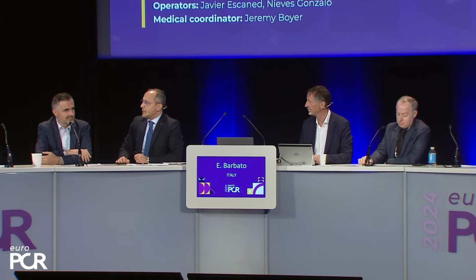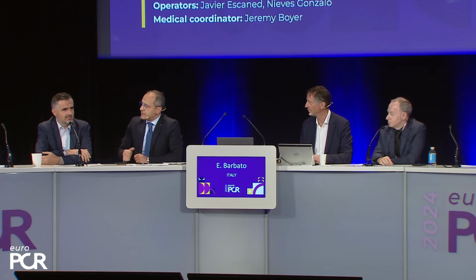Okay, let's progress. I'm coming back to you because I have the most difficult question for you. What are the challenges that we can anticipate in this case? It's not an easy job here. But in your mind, when you are preparing yourself to do this kind of procedure, I think you have an algorithm. If A doesn't go well, I go to B. If B doesn't go, I go to C.